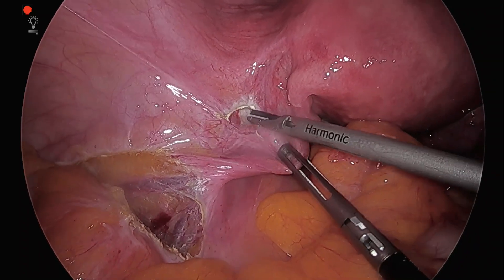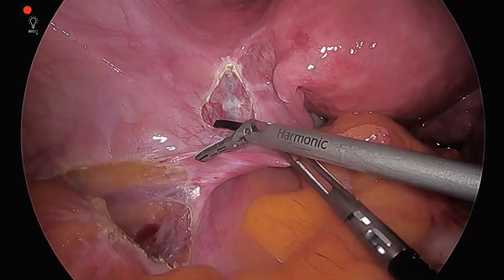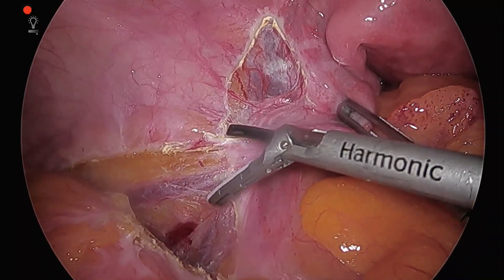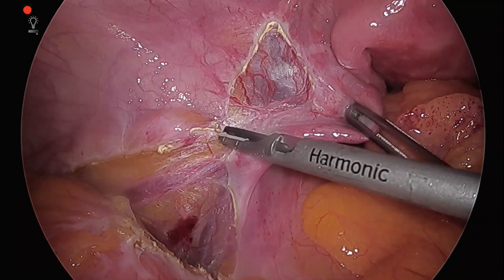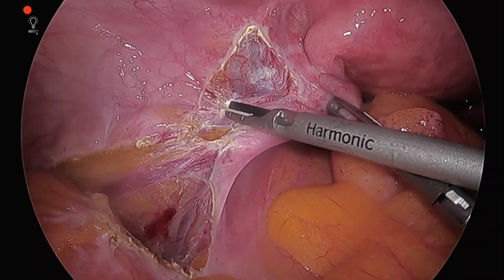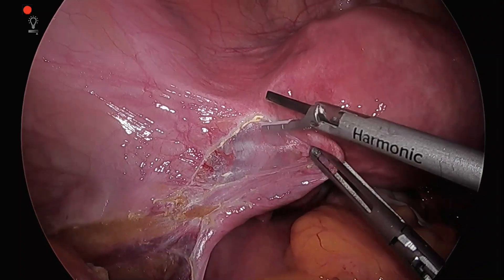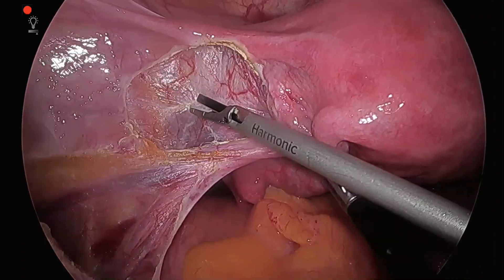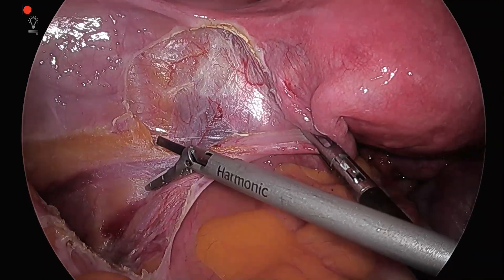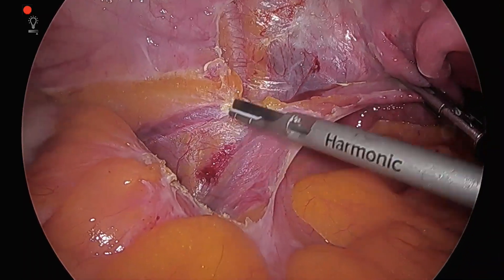Now the infundibulopelvic ligament is being mobilized. Since we are going to preserve the uterus, the uterine attachments have to be preserved — the round ligament and the utero-sacral ligament — to prevent it from prolapsing.